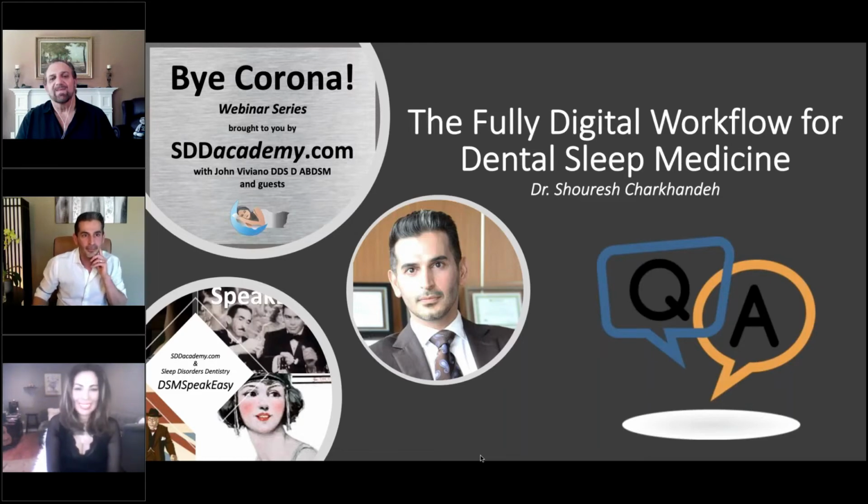I think my impression, Shouresh, is that you're really using the CBCT, as far as the volume goes, more as a patient education tool to help the patient understand the airway with the appliance in, the jaw advanced versus not, or the potential for the airway becoming larger. But you're not really using it to prove that an oral appliance would work, or as a proof of concept for the patient. You're not saying, your appliance will work because look at the airway, it looks so much bigger here. You're not saying that. No, we don't do that.